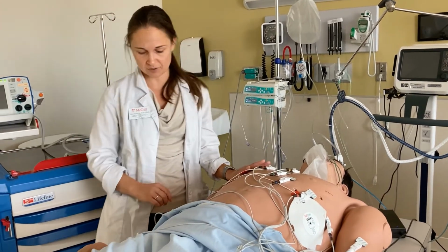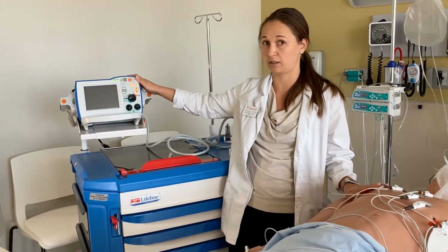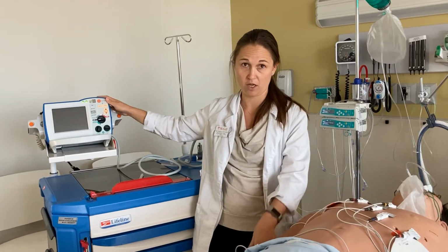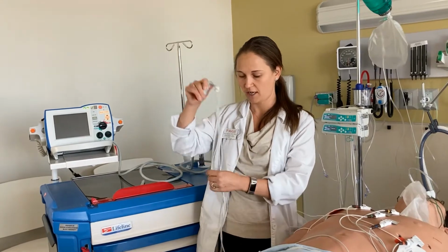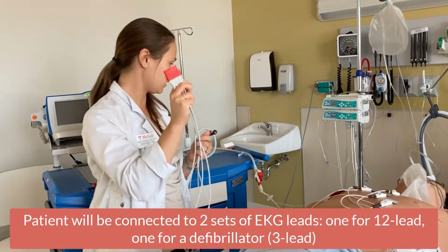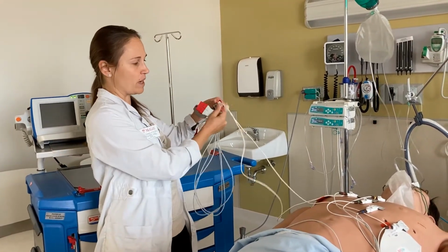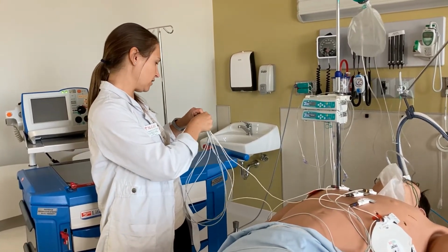So what I need to do next is I will look at my defibrillator, and the procedure for cardioversion is a little bit different from defibrillation. What I need to make sure is that my defibrillator can actually read the patient's EKG. So I need to connect extra leads to my patient, and these come with the defibrillator. It's usually a 3-lead EKG that comes with it, and you will see that this plugs directly into the same connector as you have for the paddles. So my pads are connected here, and my EKG will go and connect right over here.